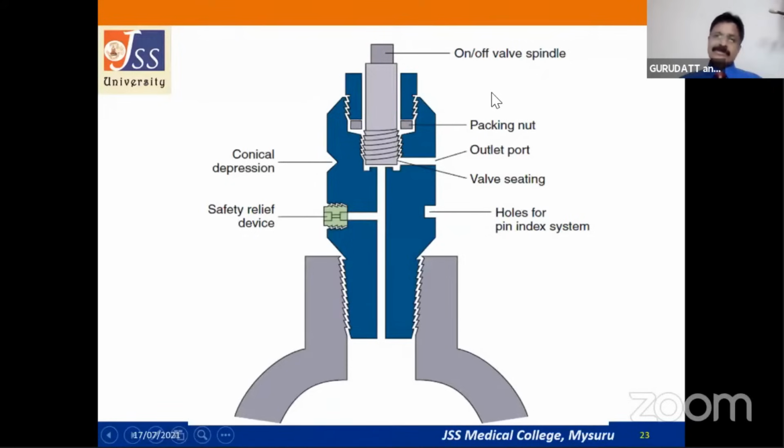When I asked the internal examiners why none of the students knew how to open the cylinder, they said that all the time, 24 hours, we have the pipeline system. But that is not the answer. Every student should know how to open the cylinder, and every morning before you start, you should open the cylinder and see whether backup gases are available whenever there is any exhaustion of the pipeline gases. So you always have to open the spindle, otherwise called the stem.